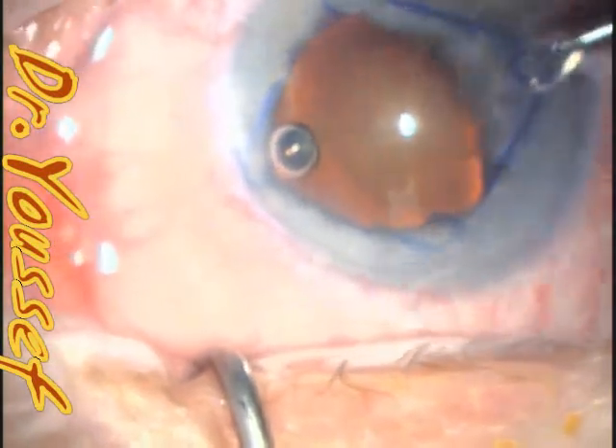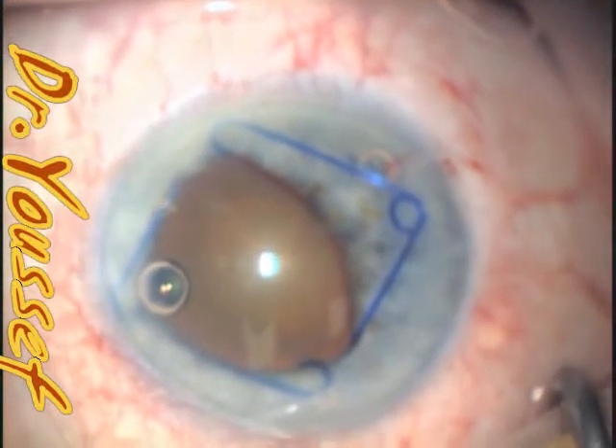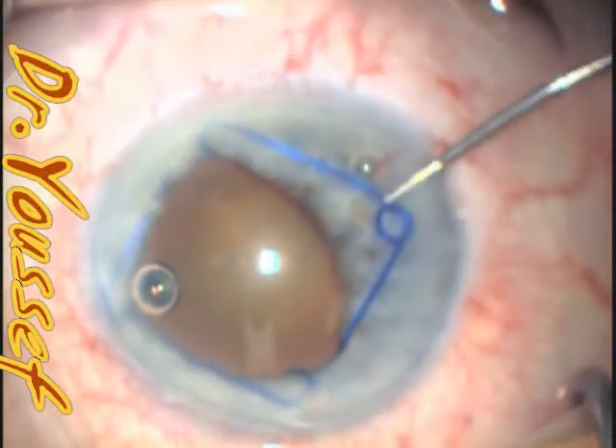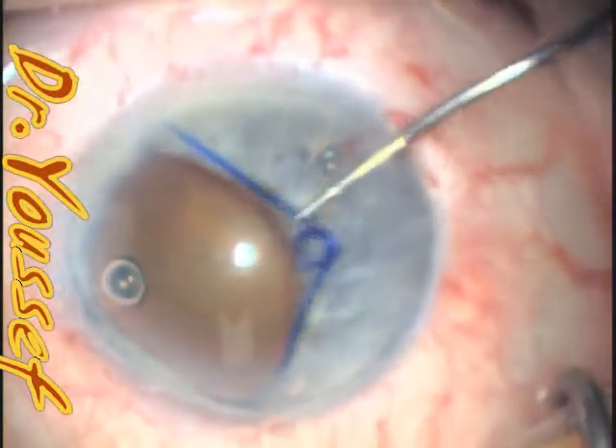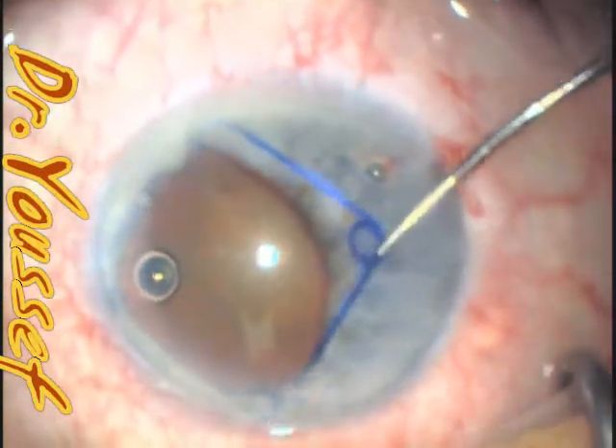the temporal one — I'll just rotate it 90 degrees so that it dislodges it from the injector. And for the trailing part of the ring, I would use the manipulator that comes with it, or the mushroom, or button, or the McPherson.